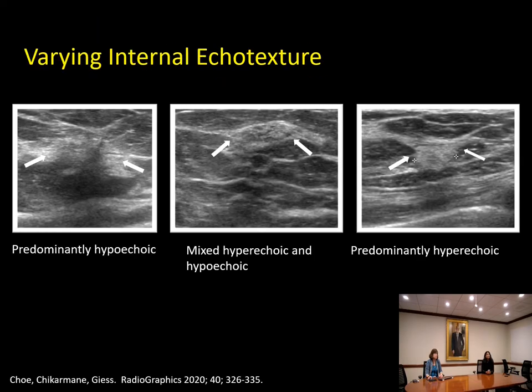Now we'd like to talk with imaging about varying internal echotexture. That can range from predominantly hypoechoic, like the image here on the left, to a mixed hyperechoic and hypoechoic area — this lesion oriented parallel to the normal planes of the breast — and predominantly hyperechoic, with possibly smaller hypoechoic areas internally.